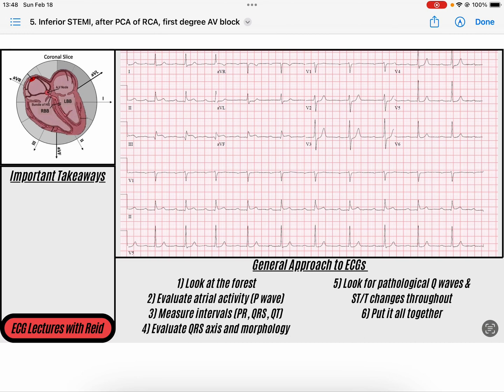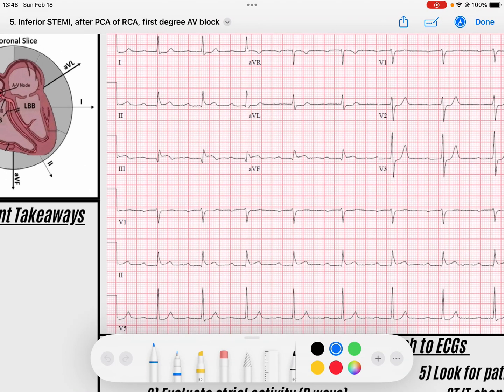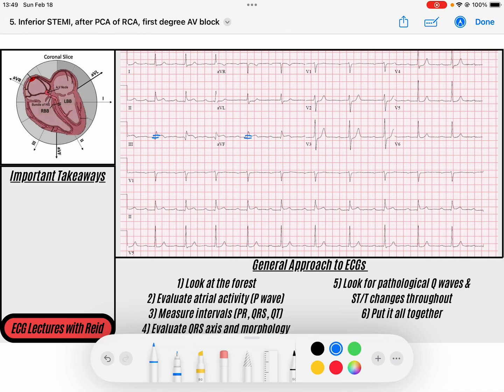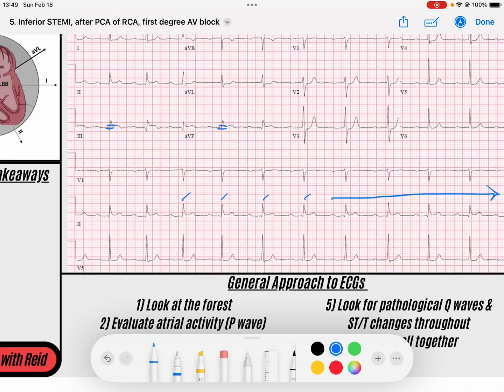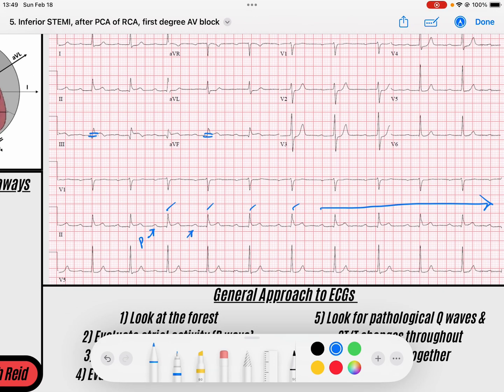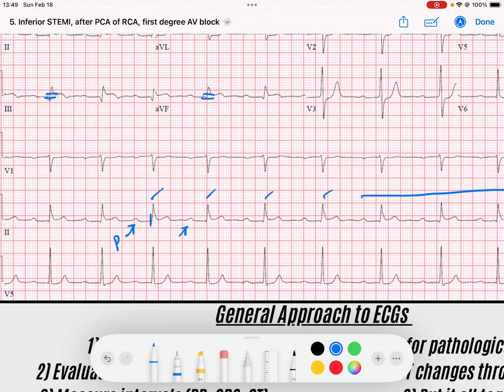Let's look at another example. Here we have somebody who's actually had an inferior myocardial infarction. You can see here we've actually got evidence of some ST changes. Just for all of you who are curious, we've got an inferior STEMI. Let's take a look and see what else we have. We have a narrow complex QRS that's regular. You can see it's regular throughout the entirety of the rhythm. You can see we have P waves in front of my QRS complexes. But if you look at the PR interval here, from the beginning of the P wave to the beginning of the QRS, we would say that that's about eight to nine millimeters. We'll call this nine millimeters, that PR interval, which means that my PR interval is nine times 40, so 360 milliseconds.